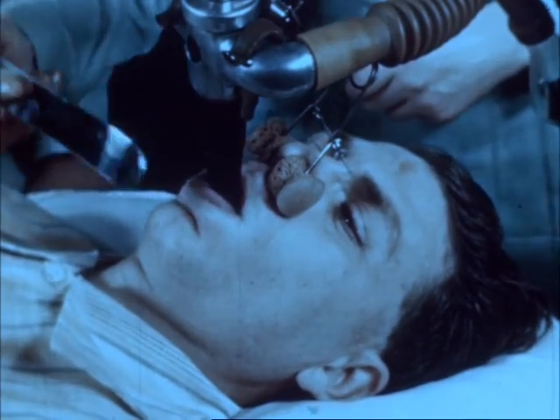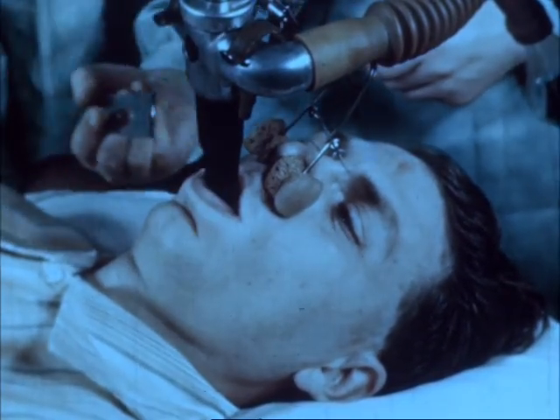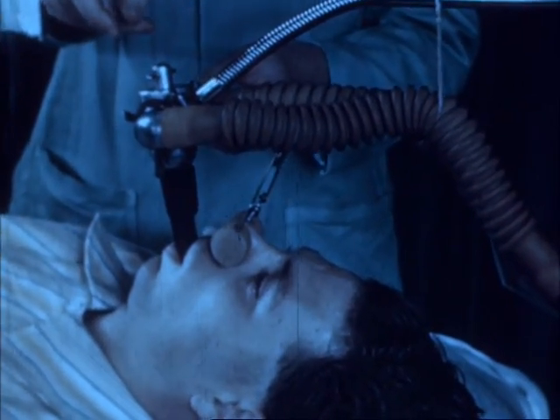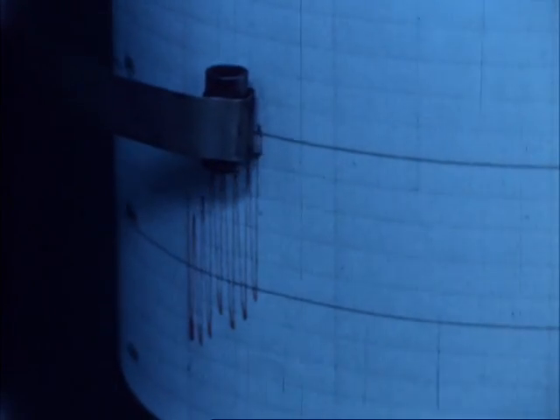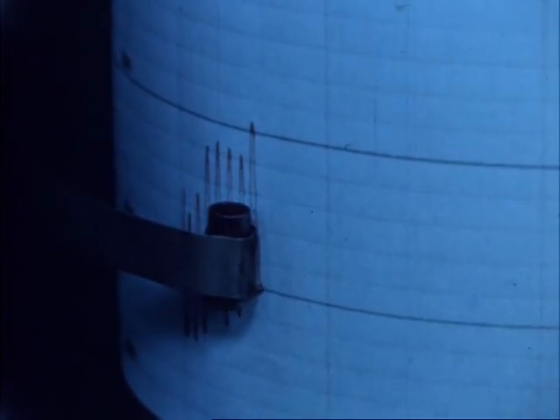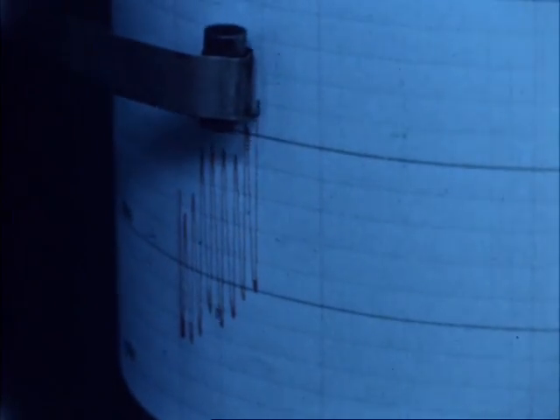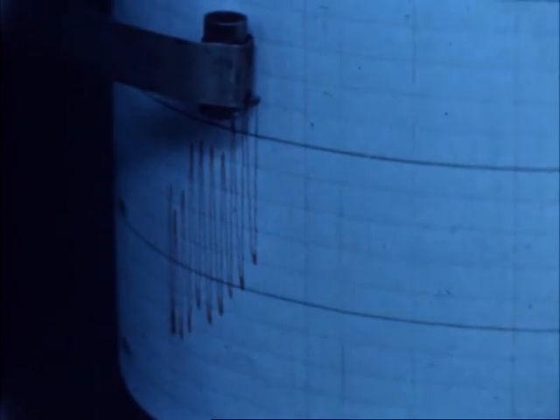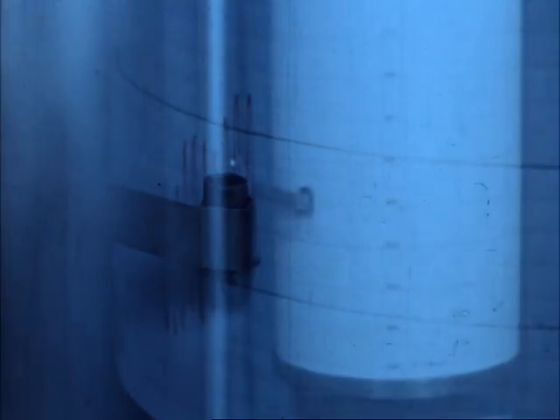The absence of leakage at the nose and mouth is ensured by testing. The tap is then turned, enabling the subject to breathe to and from the spirometer. The spirometer bell rises and falls with each respiration, and these movements are written by an attached pen on a revolving drum. As all the exhaled carbon dioxide is absorbed by soda lime, the volume of the spirometer decreases owing to the absorption of oxygen in the lungs.